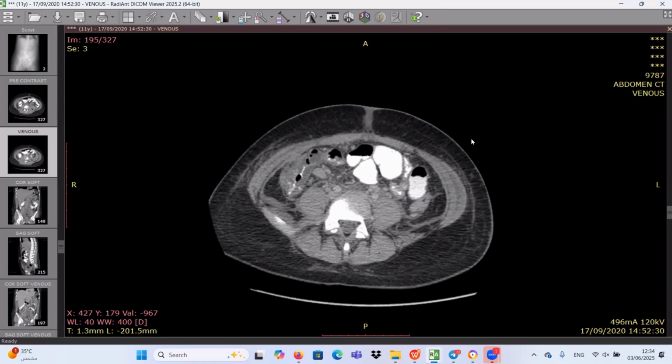Sir, if the patient has neutropenia, it could represent typhlitis too, for which I would correlate my findings with the clinical picture of the patient. Sir, we don't have any evidence of neutropenia or chemotherapy or something. We don't have any history for this one.